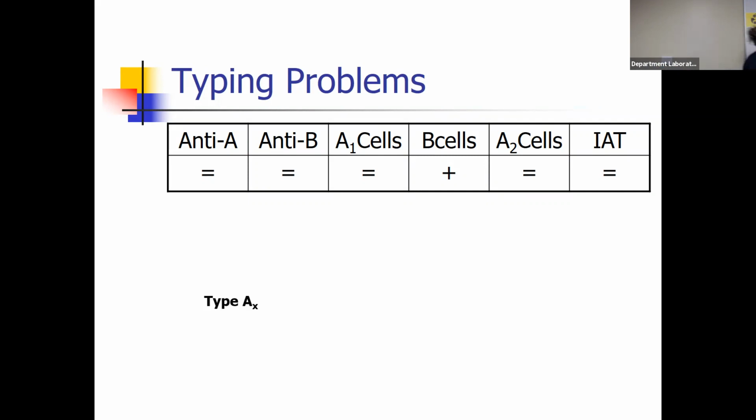A good rule of thumb, anytime A1 lectin and A2 cells run together. Why A1 lectin wasn't included here, I'm not sure. But if you perform A2 cells, you also run A1 lectin. They are always performed together. They might have included A2 cells just to let you know that it wasn't a type O patient with a weak back type right here.